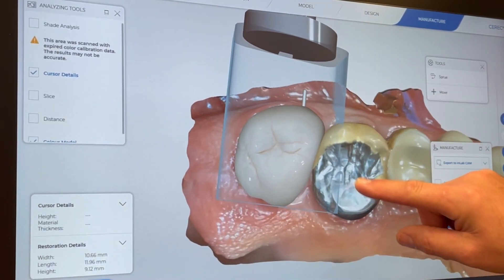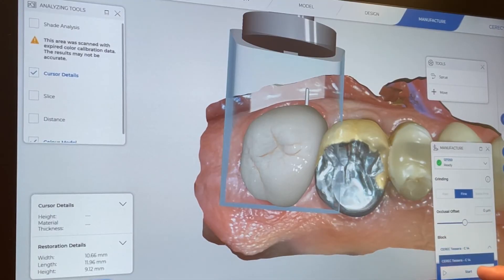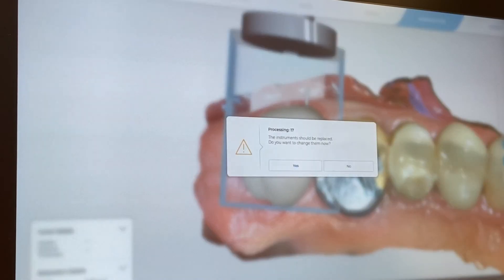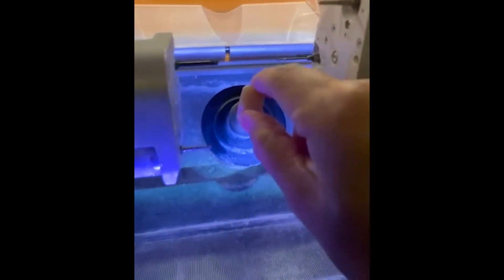Here's our crown within the milling block and sprue in position. If the sprue is not in the right position, move it — try to avoid any interproximal or key areas. Confirm you have the right block and the right size, load your milling chamber, and proceed to milling. Here it's sending information to the milling chamber — we click start and begin milling. In this case we select the Tessera block, an HD A2 C14 block, place it into the milling chamber, ensure it seats fully and locks in, then tighten the screw with the supplied screwdriver. Milling time on the M6L was about seven to eight minutes for this molar.